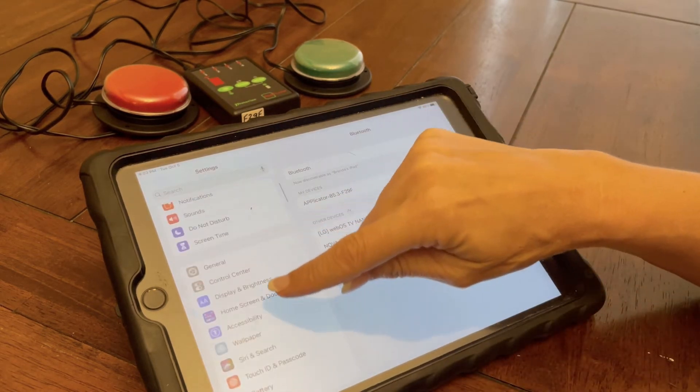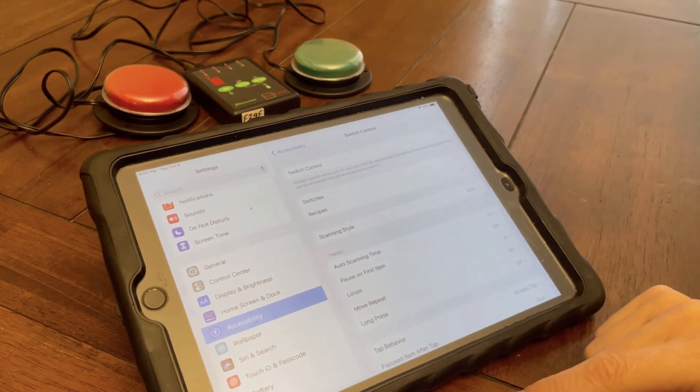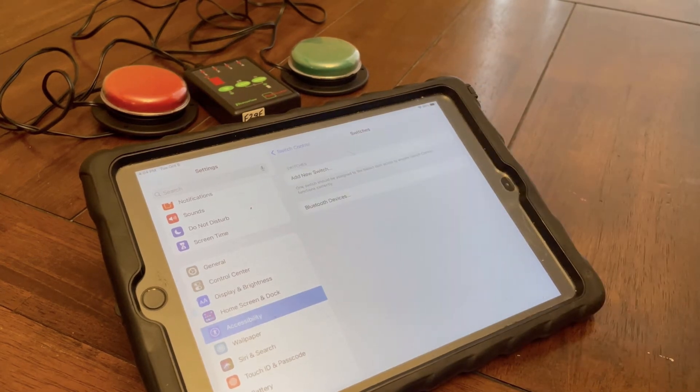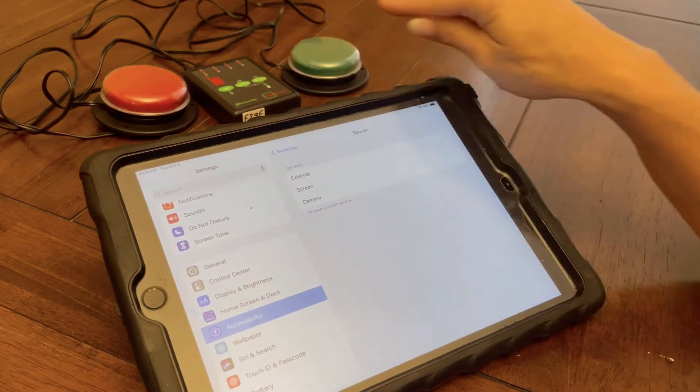I'm going to go down to Accessibility and go into Switch Control. Here is where I will set up my switches and show you the recipes. Here I can add a new switch — these are external switches.